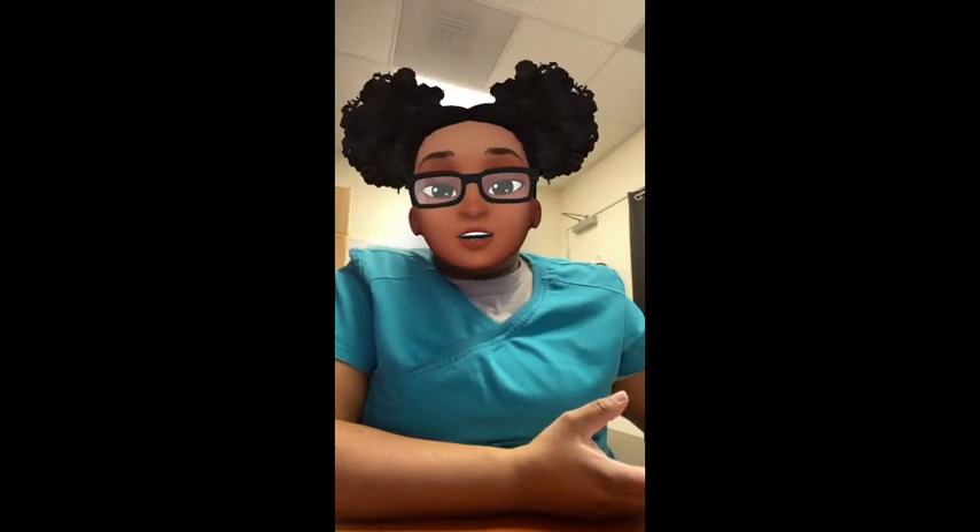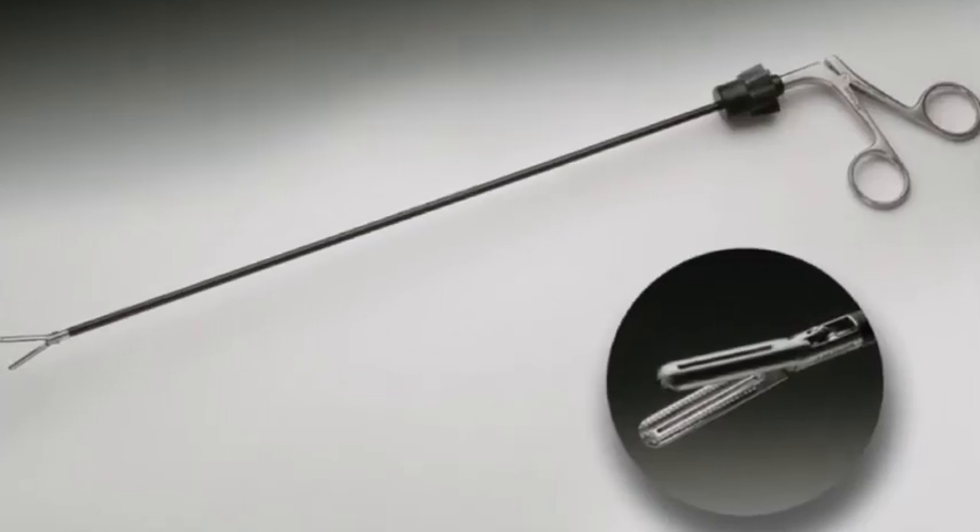We have the hunter bowel grasper. When you get into bowel cases, these are the ones you'll usually use. They're often called 'flat' instruments or a flat grasper, but it's for grasping and holding. Just make sure you know it as your hunter bowel grasper.